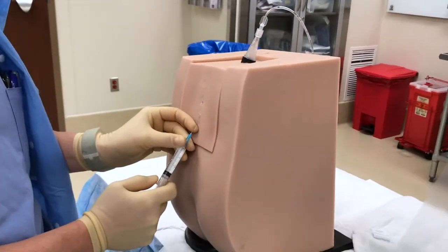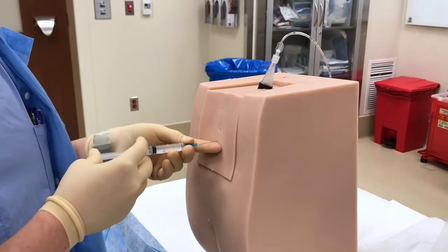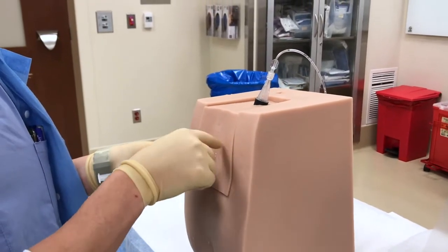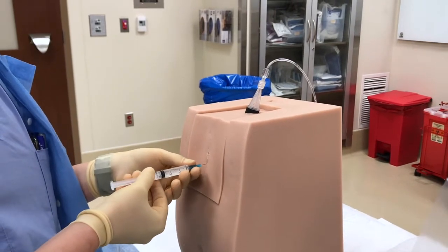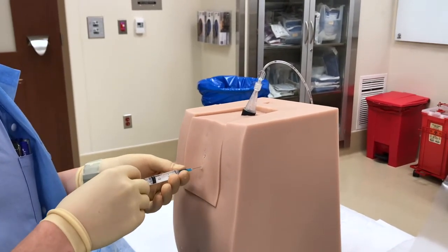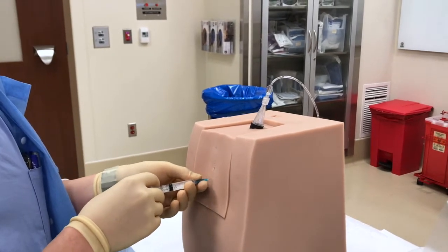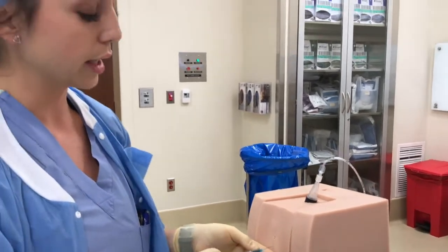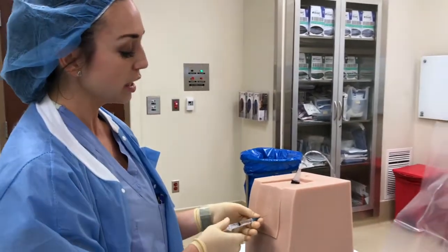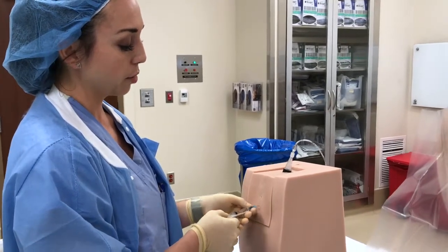Obviously, you're not going to be able to see it on this mannequin, but a good skin wheel is kind of what we're looking for, making sure that you're covering all of the superficial areas, and then you can penetrate deeper and inject your local solution in all of the areas that you may be going. And so you can use, again, as we mentioned in the C-section video, this numbing needle also as a finder needle, so you can kind of redirect up, down.